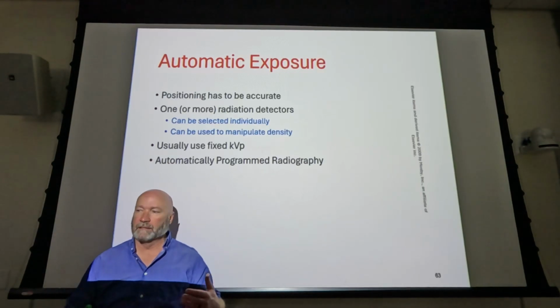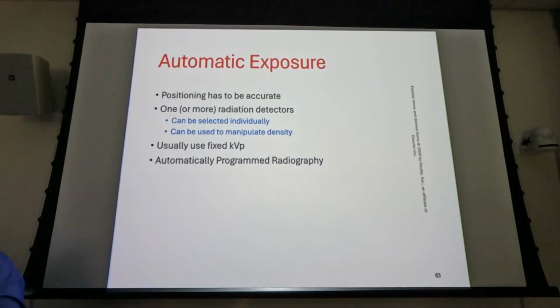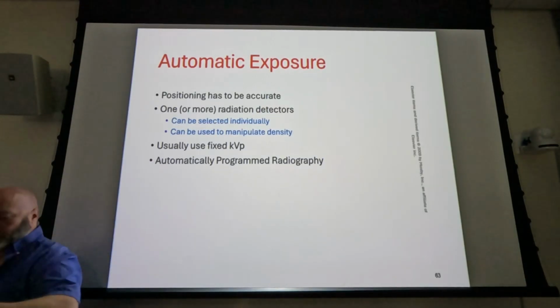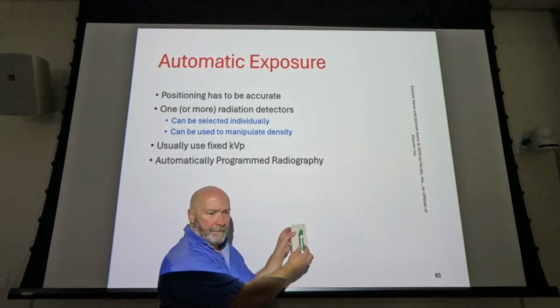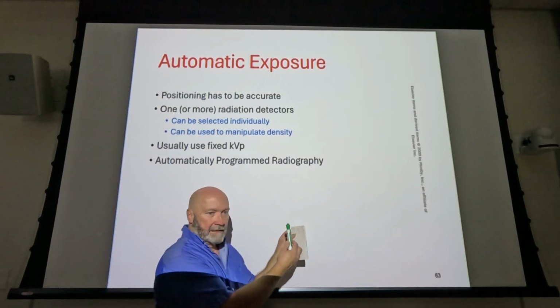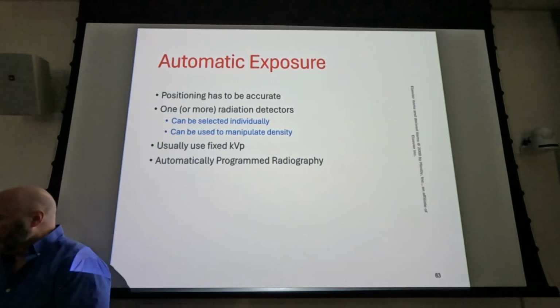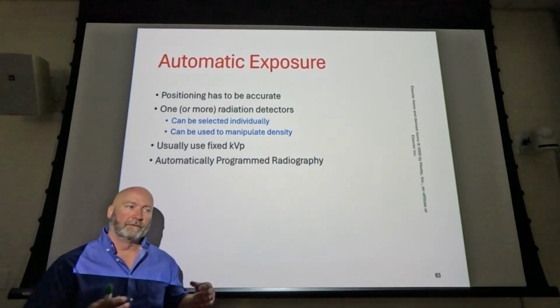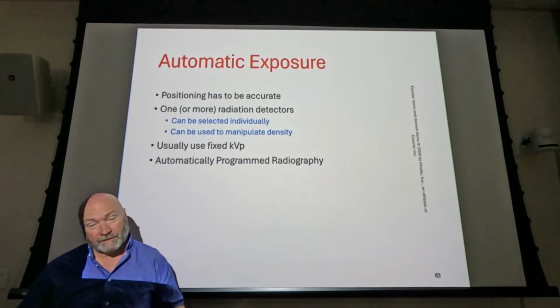So the bone needs to be positioned directly over the AEC, and the AEC may be about that big. So are you going to be able to completely cover the AEC with the anatomy of interest? The answer is no. Will the rest of the upper arm compensate a little bit for that? And the answer is yes.